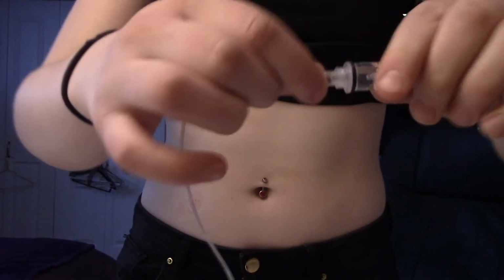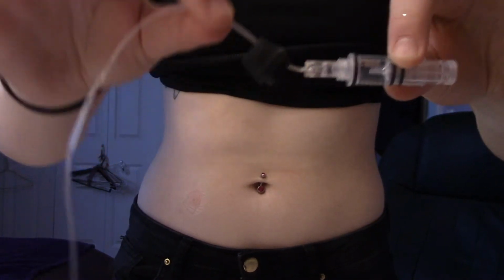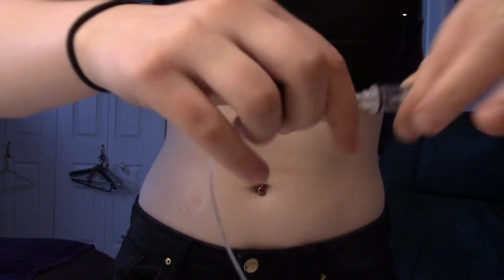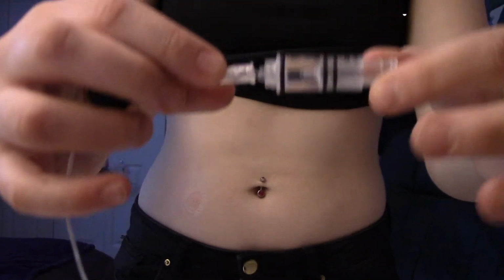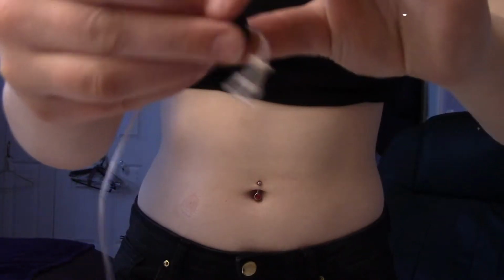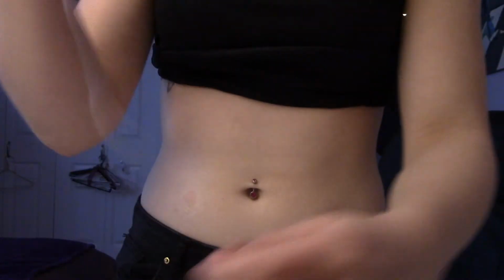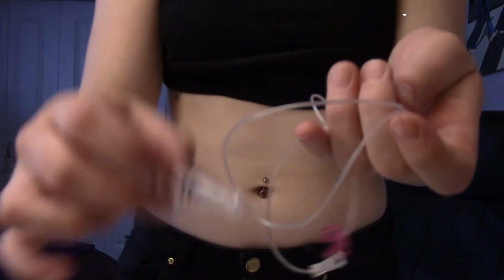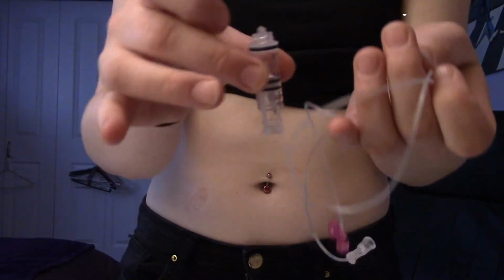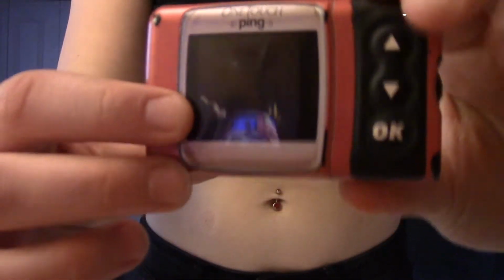So what I'm gonna do, make sure I keep this black thing. Don't want to throw that out. It's necessary for the next time. I'm gonna twist this part off here. Sorry guys. Pull it off and take my black part off. Boop. Super easy. And this part, as well as your old cartridge, are going to be going in your sharps box.